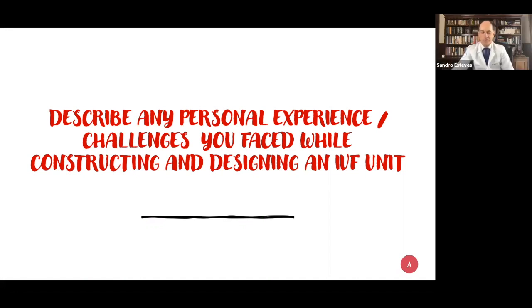Thank you very much for the kind words, Ashok. First of all, I have been lucky to have my wife as quality manager in our program, so extremely lucky in that regard. So in terms of personal experience, perhaps I could offer three pieces of advice. In the design phase, try to design your facility a little bit larger than you think you need for that moment, because renovation is quite complicated and in many cases you need to stop doing IVF cycles. So try to make things the way where I want to be in 10 years, for instance, and try to design it a little bit bigger.